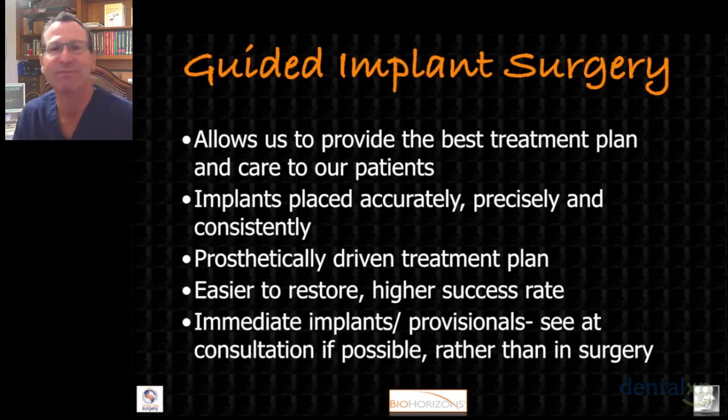So we're not flapping the site open and placing the implant where the bone is. We're planning the prosthesis first and placing the implant where it needs to be for those final prostheses. And because the implants are placed more ideally in the bone at better angles, they're easier to restore and easier to maintain for the patient, hygiene's improved, and we have really a higher success rate with guided implant surgery than we do with freehand implant placement.